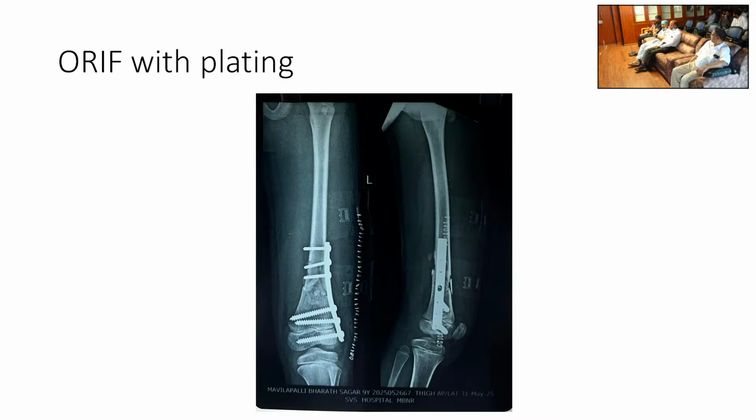That is a fixation device, it does not hinder the growth, for transient hemiepiphysiodesis, which is temporary. After the desired result has been achieved, then the plate would be removed. It is something like that.